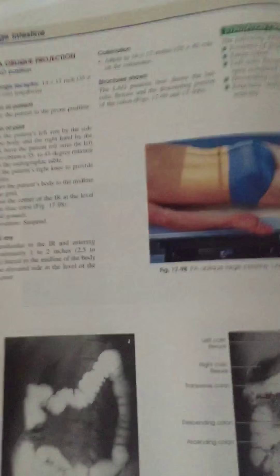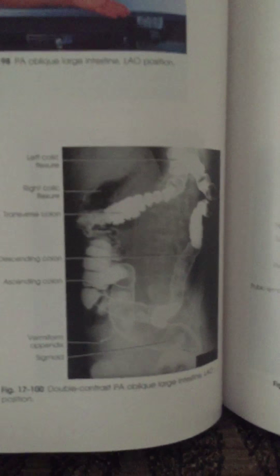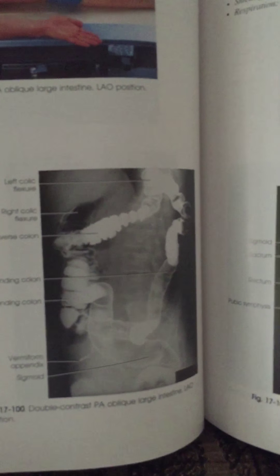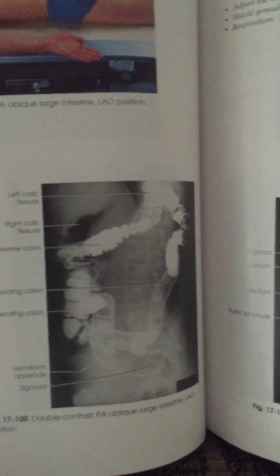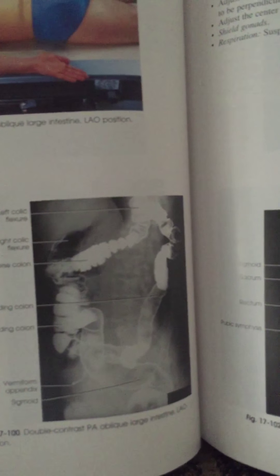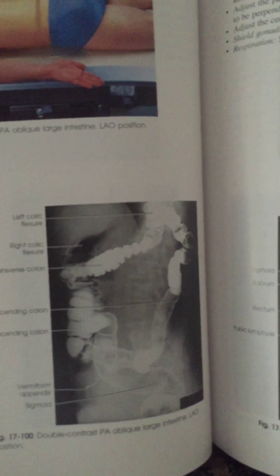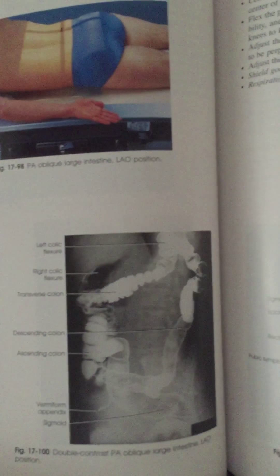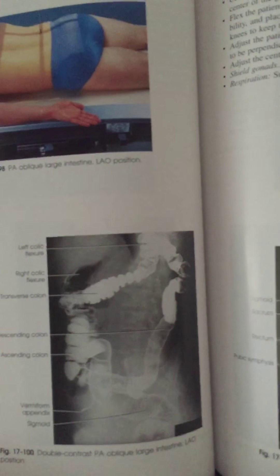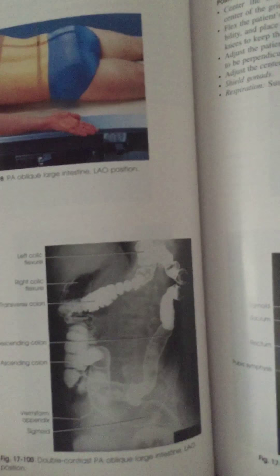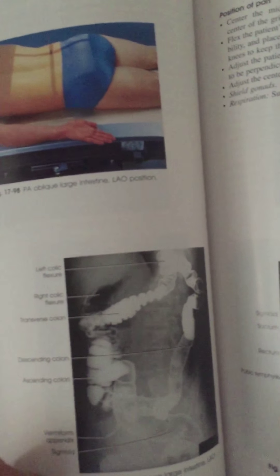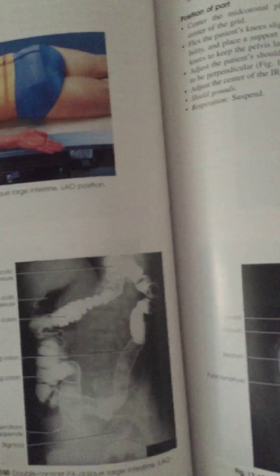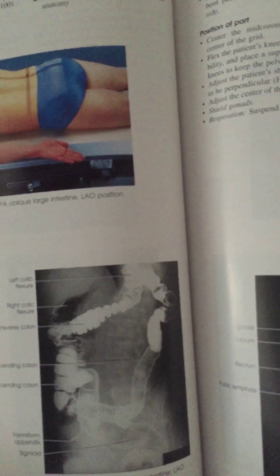Next I did the LAO position. Here you want evidence of proper collimation, the entire colon visible, and the left colic flexure less superimposed or open compared with the PA projection. You want full visibility of the descending colon and an exposure technique that shows the anatomy.